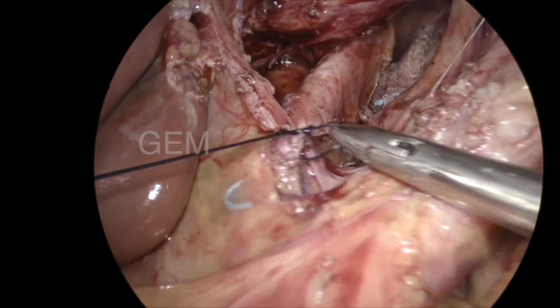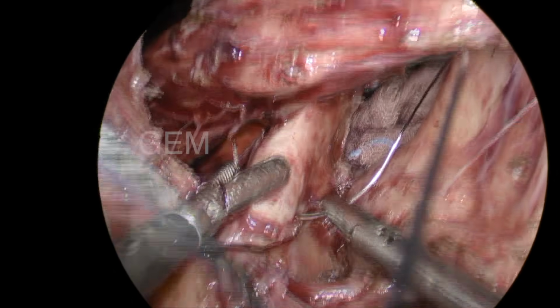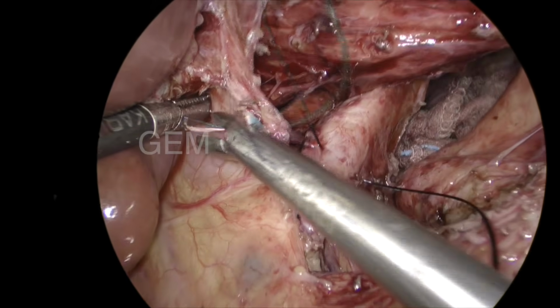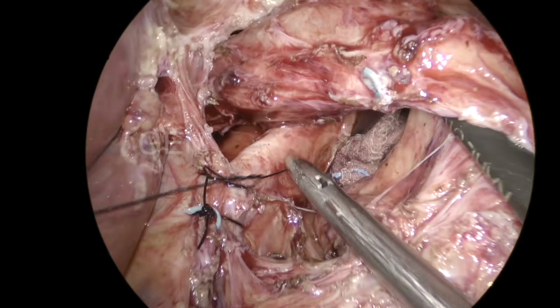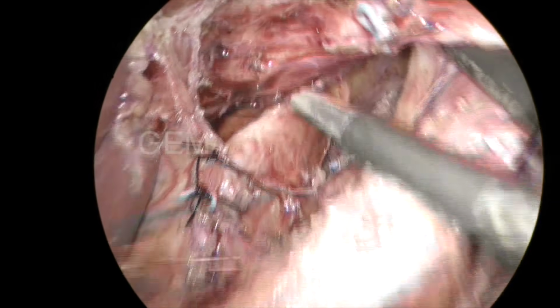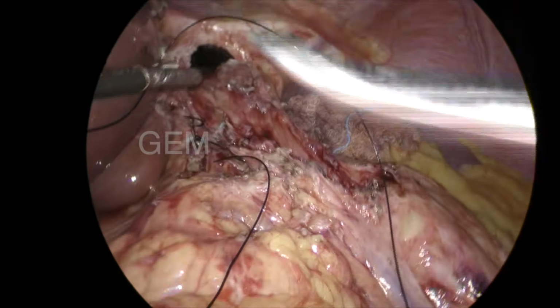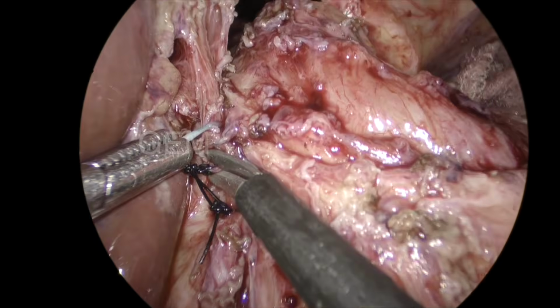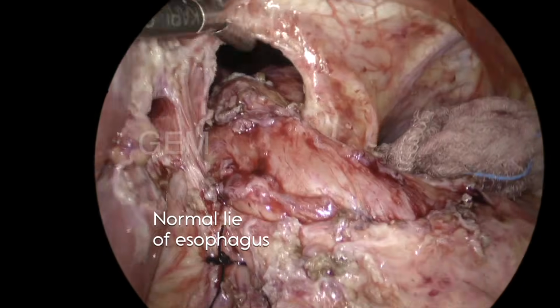This is one of the strongest sutures, nylon suture, otherwise called polyamide suture. I am taking another suture. This is a 1-0 polyamide suture with a 40 needle. Now I could see tenting of the esophagus after these two sutures. The esophagus doesn't look straight. It is tenting near the hiatus, near the crus. So I divided this second suture, and now you can see a straight, normal lie of the esophagus.